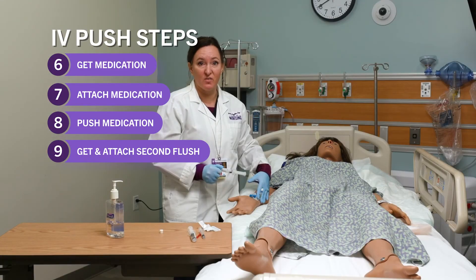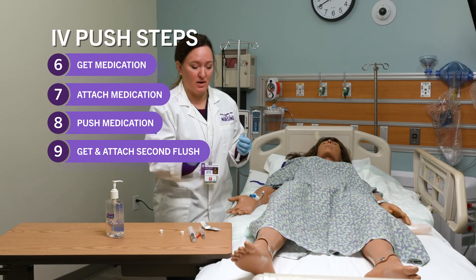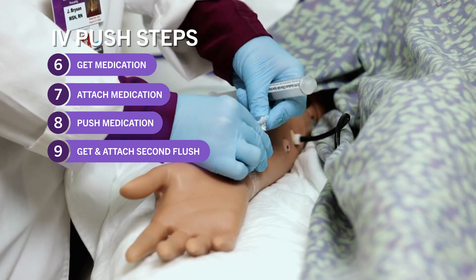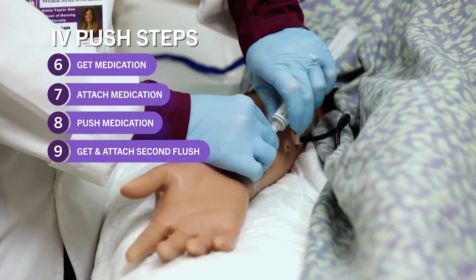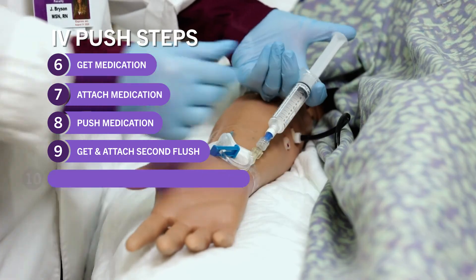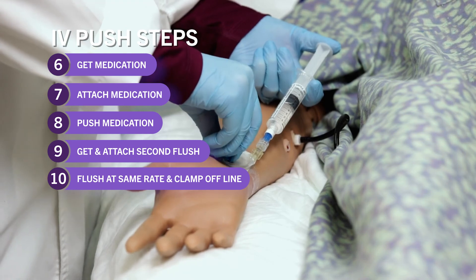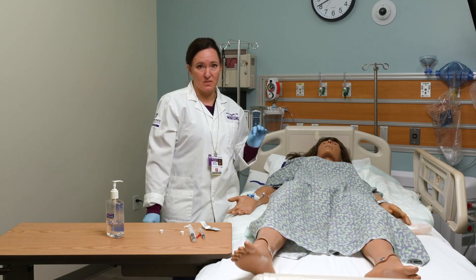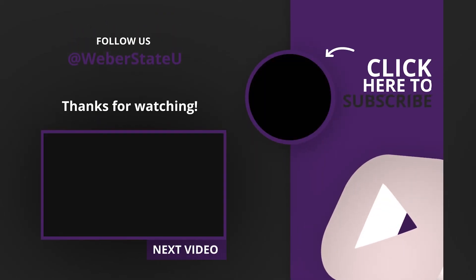If you have to set down your clave, you'll need a new alcohol wipe and you'll need to clean your clave again — 15 to 30 seconds. Then do your post flush at the same rate as you pushed your medication, three to five milliliters. End by clamping off your line if you're not going to use it. If your facility has alcohol caps, you can add one to the end of the clave and you're done.